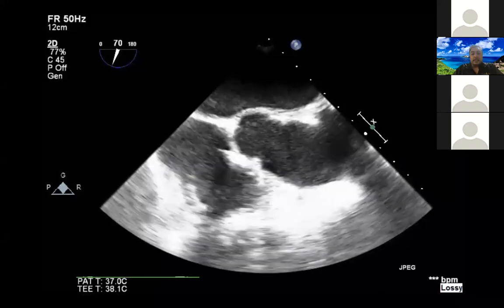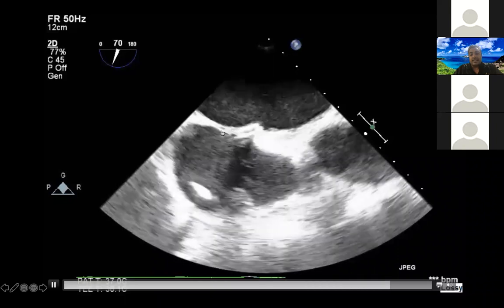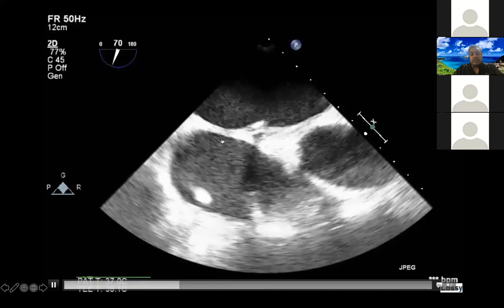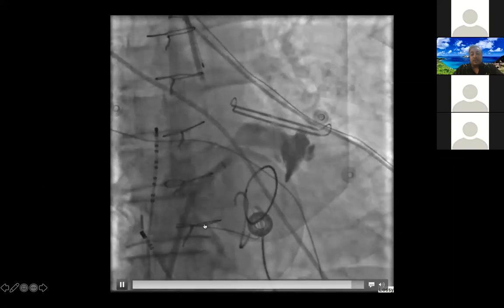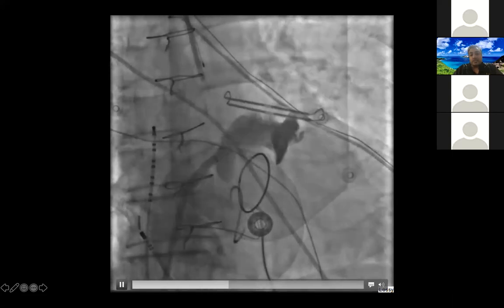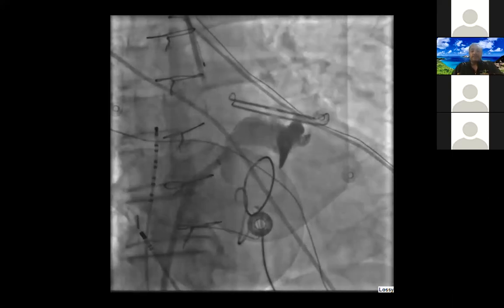This is that example of the left atrial dissection. It's kind of hard to see, but the sheath is actually not in the left atrium here. It's actually in between two tissue planes. And so when we injected contrast, you can see the contrast is basically just going into the wall of the atrium. So fortunately, we were able to pull back here, and in this case, we stopped the case. But again, this is one of those complications that I hadn't really heard about until I encountered it.